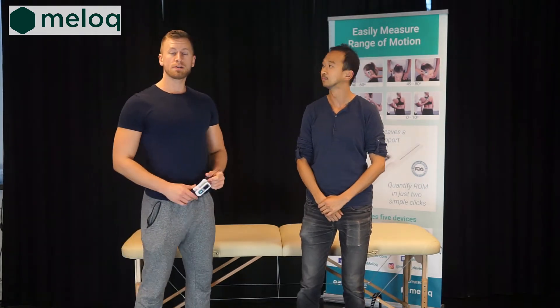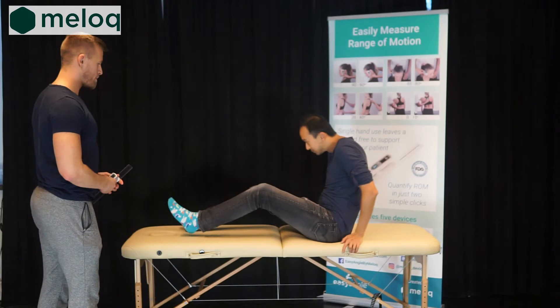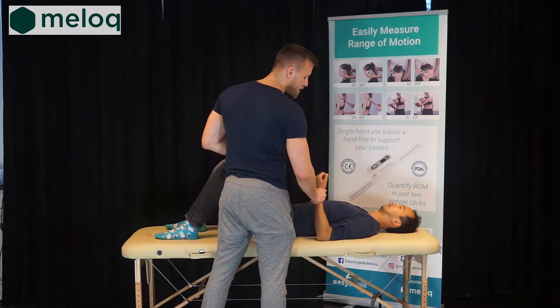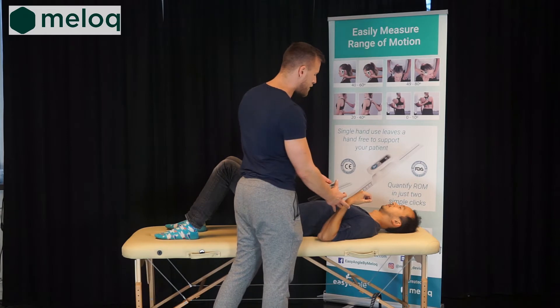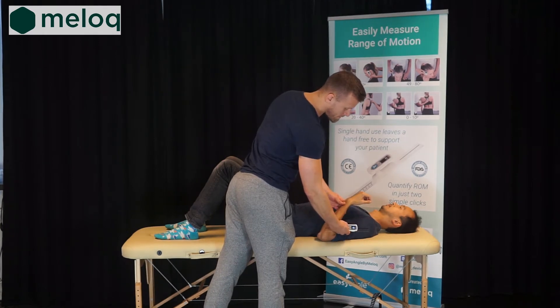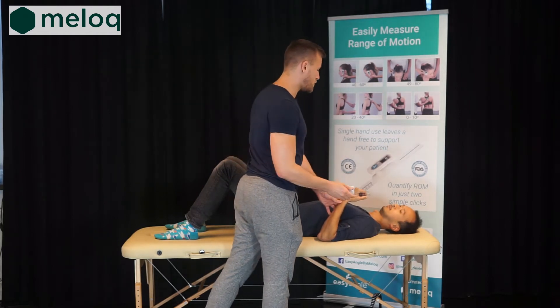We will start measuring range of motion with EasyAngle, firstly by instructing the patient to lay on his back. Since we are measuring the elbow, we will bring the forearm into flexion. We can use one arm to support the patient and the other to perform the measurement. We will turn on the device, align it, start the measurement and end the measurement. We can read the results and at the same time show them to the client.